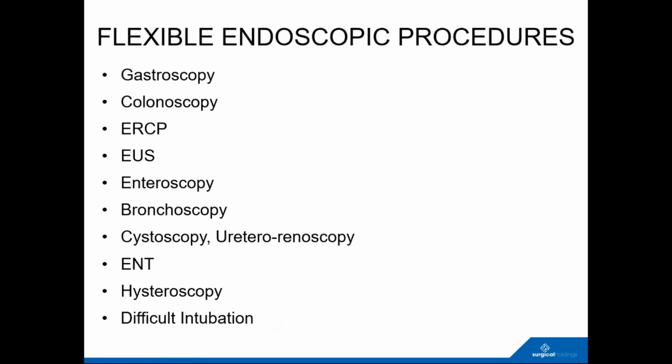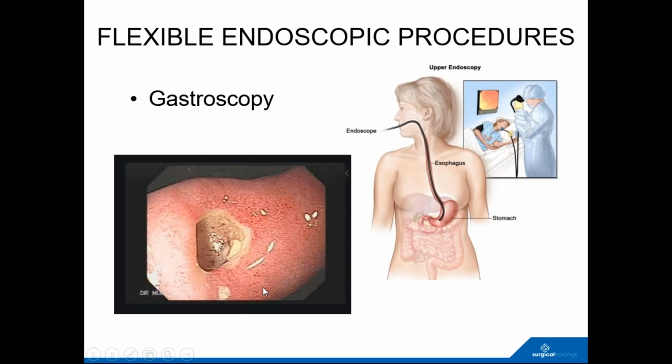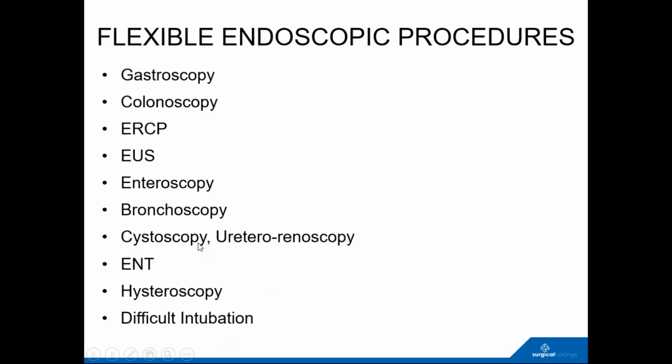So Nick, sorry, just obviously where you've got rigid cystoscopes and hysteroscopes as well, what would be the reason for choosing flexible as opposed to using the rigid variety? Principally, at the risk of sounding simplistic, it's patient comfort. There can be advantages and disadvantages of both, but to use the cystoscopy example, having a flexible cystoscope put into your urethra is a lot better than having a rigid cystoscope put into your urethra, and a rigid cystoscopy would normally be under GA.